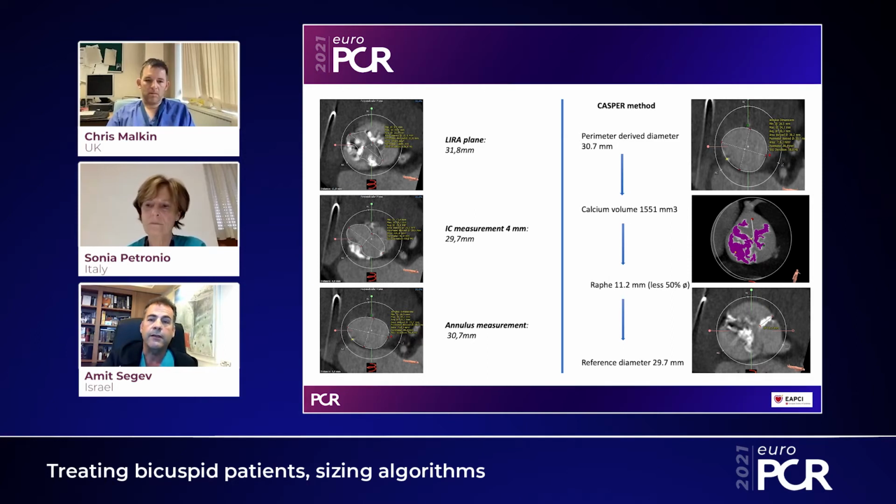And in these cases, of course, you have to undersize the valve that you use. In this case, although you have a case which is beyond the 34 millimeter valve, you can actually be safe and try to implant a 34 millimeter based on the tapered anatomy. In terms of how you implant, because you rely on what I call a virtual annulus, the implantation in relation to the true annulus should be at 0.